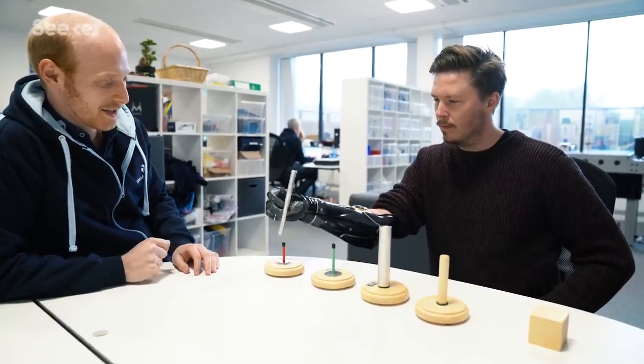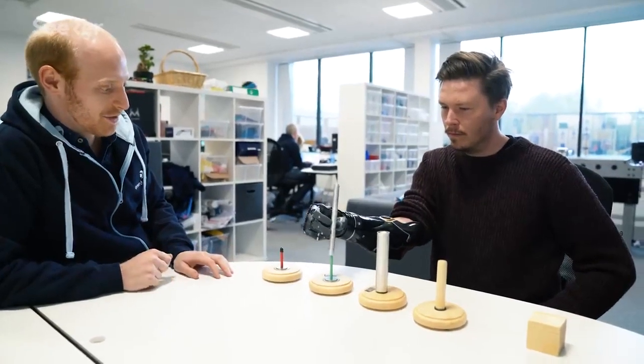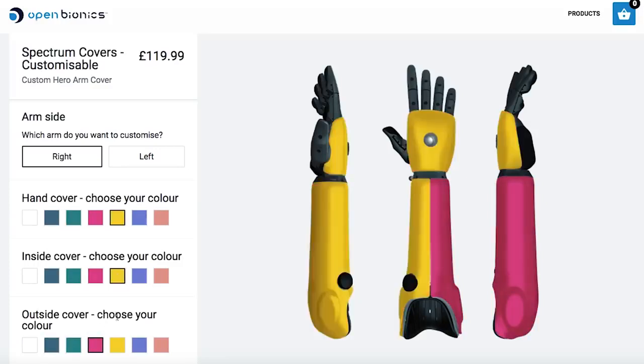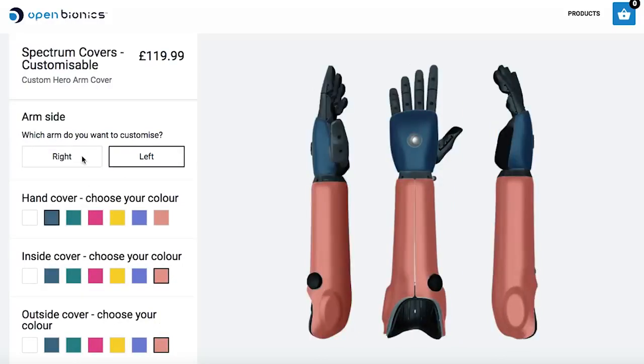That's one of the things we're most proud of — the fact that you can change the look and style of it. We've got a customizer so you can design it yourself, change the colors. It's an expression of individuality and it means you have a choice over the way your prosthesis looks.